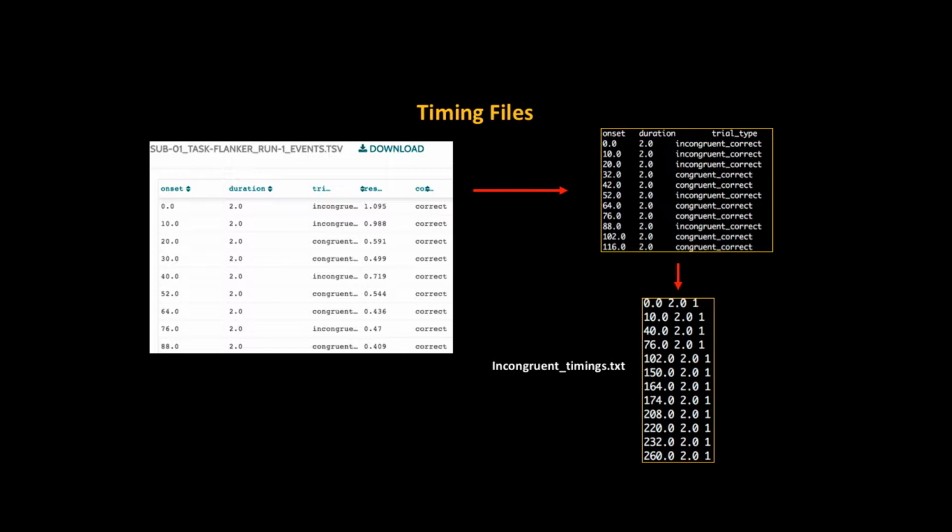There was one lab in the Northeast that I was consulting for, and they'd collected maybe 70, 80 subjects, and they hadn't looked at any of this. They hadn't looked at their timings at all. That's crazy, because this is something you cannot recover if it's not there.